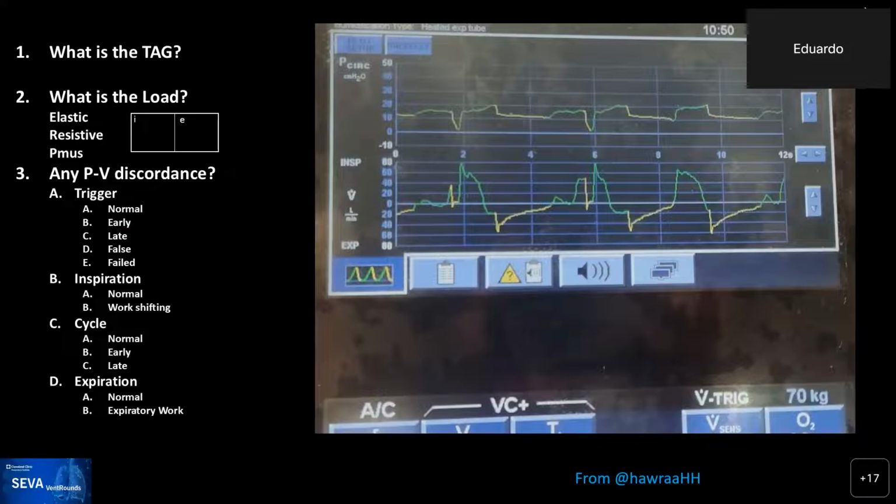But it did generate a little bit of anxiety on my part as I was reading it to try to describe the problem. So I'm going to show it for a second and see if people want to enter comments on what they think is going on with this mode. I'll give you exactly 30 seconds to type in the little screen with your thumbs.